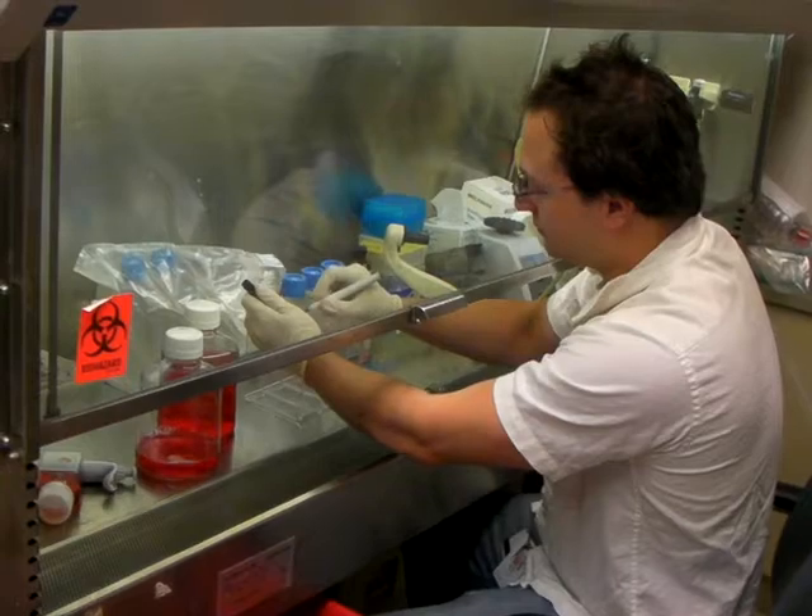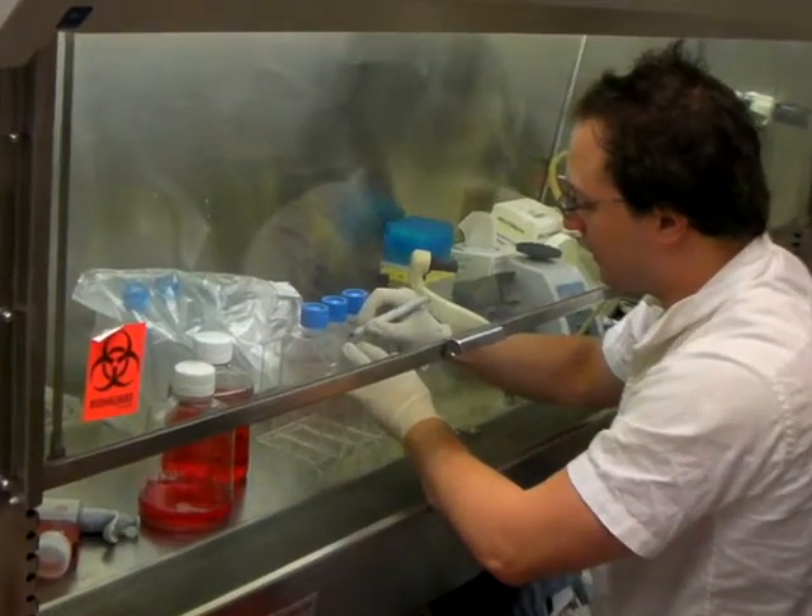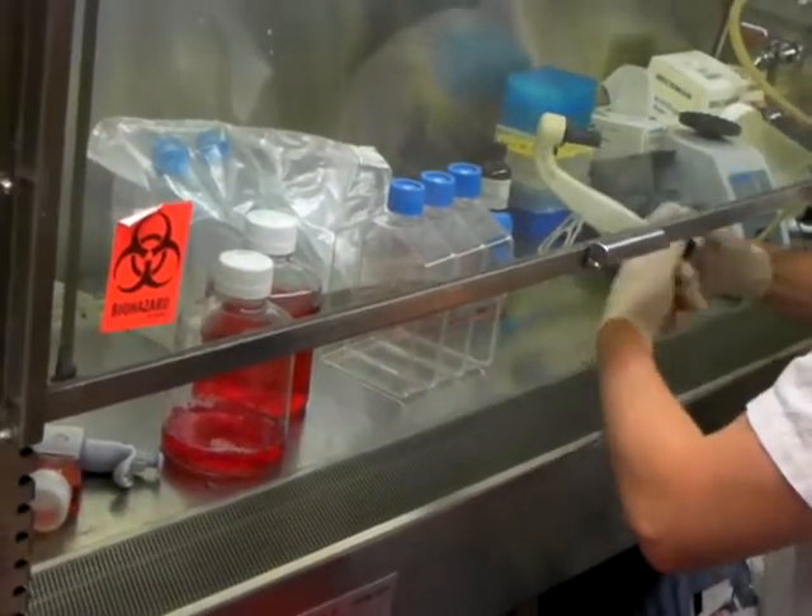Label them. These are breast cancer cell lines — MCF-7s. I'll be doing some of my research on these.